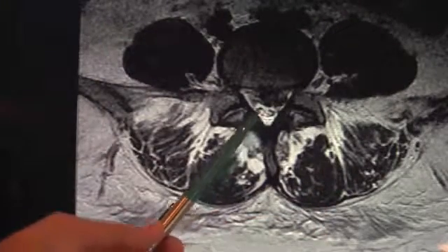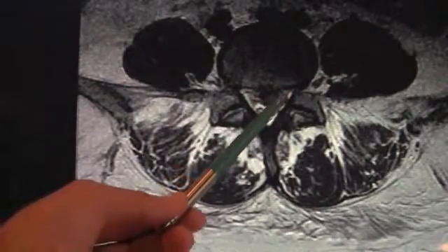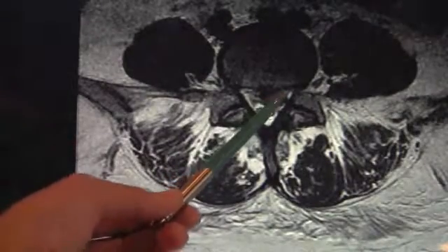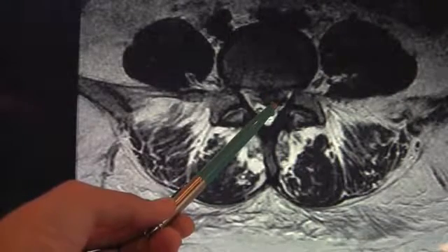This is the spinal canal. Typically this would be wide open where the nerves go through, but you can see here a very large disc herniation centrally and over on the left side, compressing the left L5 nerve root.